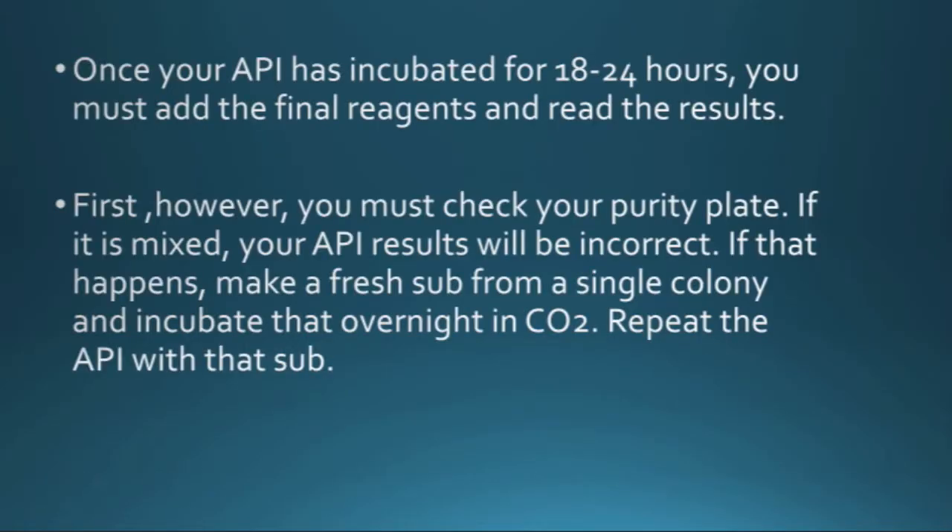First thing you have to do is check your purity plate. You have to make sure it's not mixed, because if it is mixed there's no use doing the API — it's not going to be right. If it is mixed, just make a sub of a single colony that you want, sub it to a blood plate, and incubate that overnight in CO2, then you can repeat your API tomorrow.